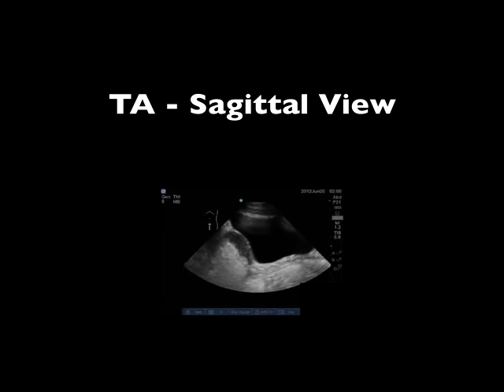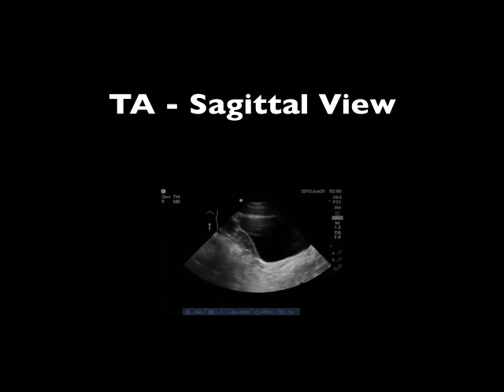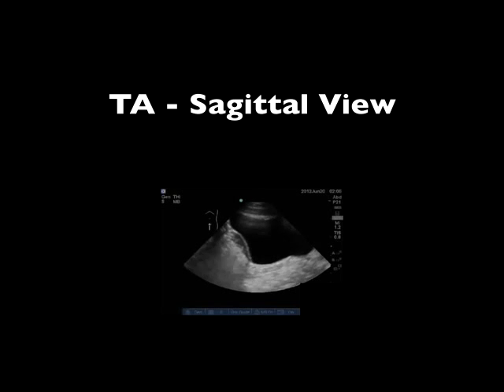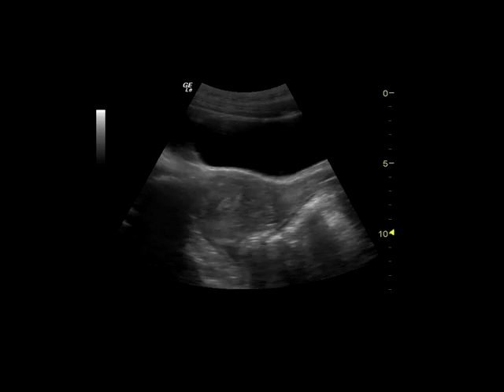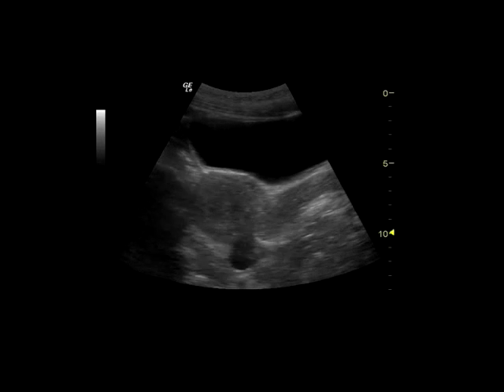Here is a video of a transabdominal scan. We can see an anechoic structure on the superficial and right side of the screen which is the bladder, and just posterior to that we see the uterus. The probe marker is pointed towards the patient's head. Remember that free fluid will collect posteriorly on the sagittal plane in the pouch of Douglas. This can happen during ectopic pregnancy, or in the traumatic setting it can be blood. This scan shows the uterus posterior to the bladder and a small amount of free fluid posterior to the uterus.